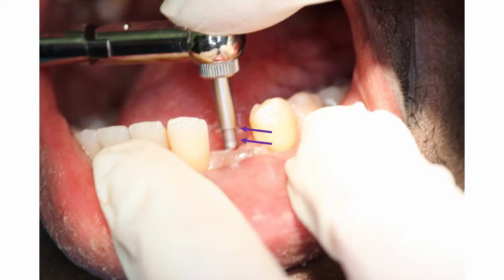You can see there's a ratchet there. Now this particular ratchet is a combined ratchet and torque wrench. Again, we'll do a separate presentation on the ratchet, because you can use that to ascertain your primary stability should you wish to do some sort of immediate loading.